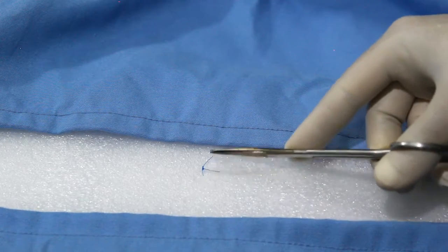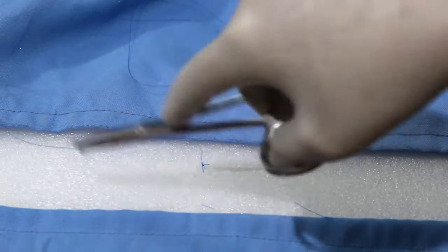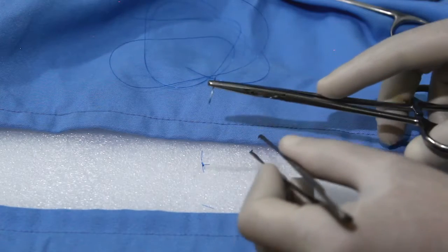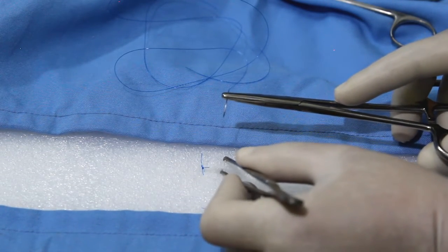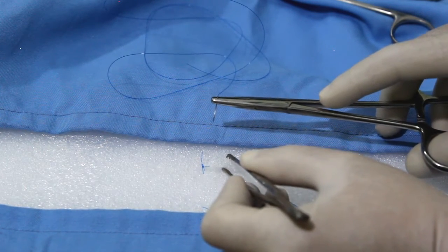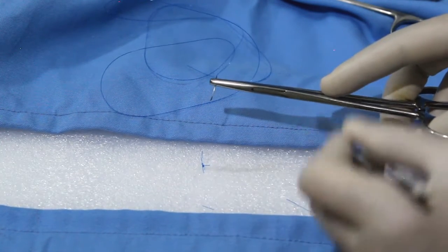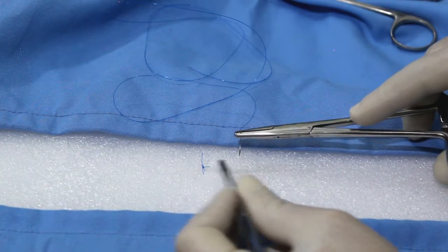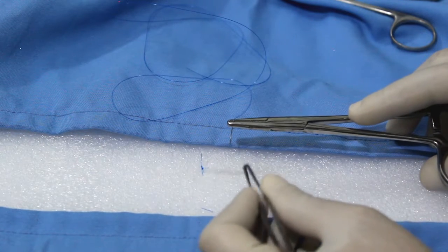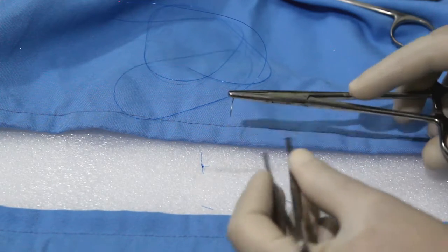The suturing action — supination and pronation — should come from the wrist joint; that is the basic movement. Compared with running sutures, interrupted sutures are easier to place, have greater tensile strength, and less potential for causing wound edema and impaired cutaneous circulation. They also allow the surgeon to make adjustments to properly align wound edges. For beginners, it is better to start from the middle and go to either side.